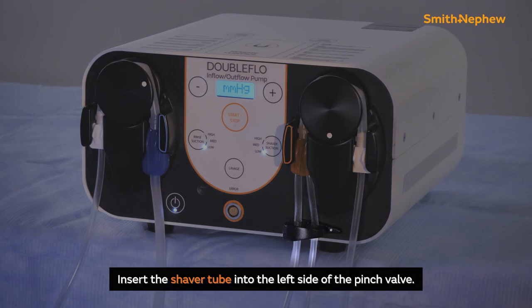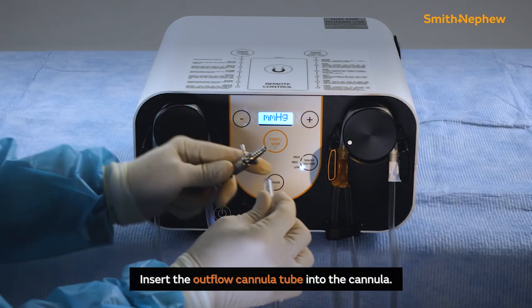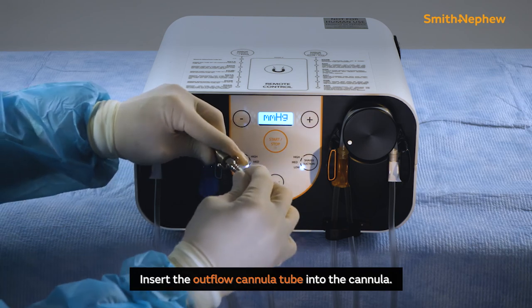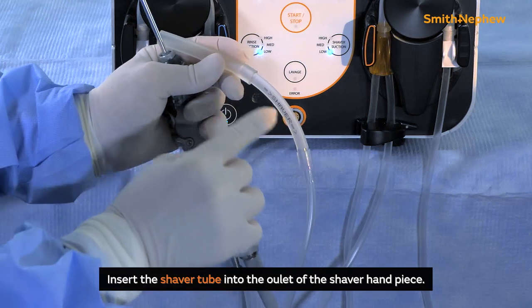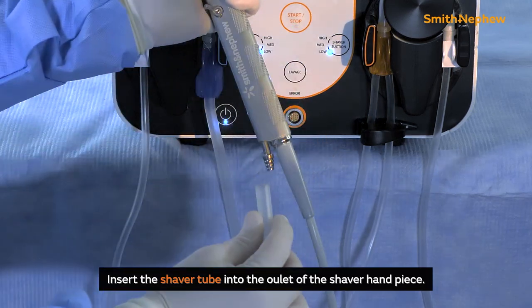Insert the outflow cannula tube into the right side of the pinch valve. Insert the shaver tube into the left side of the pinch valve. Insert the outflow cannula tube into the cannula. Insert the shaver tube into the outlet on the shaver handpiece.